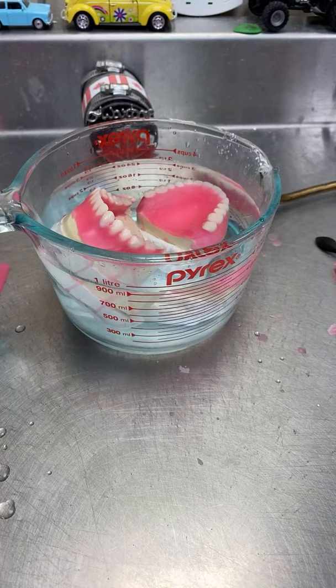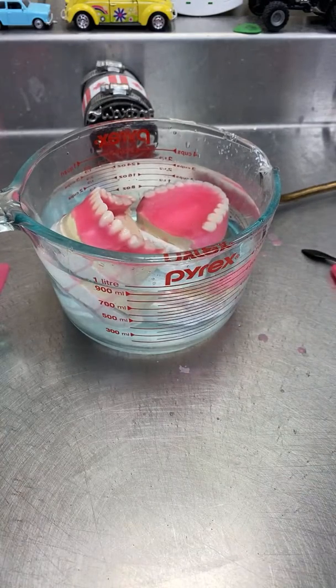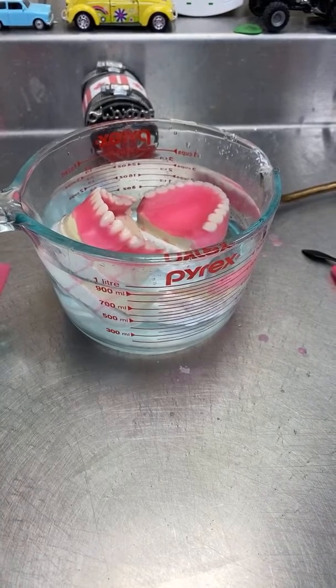I was taught in college that we make occlusal rims on a base plate, but you do it directly on the cast. I am confused. Okay, so go to my Instagram. I just posted something like an hour ago about how I do that. I use hard wax for a base plate wax, and that will make the difference. It is hard and it will not distort. But yes, in school you have to do it on acrylic.